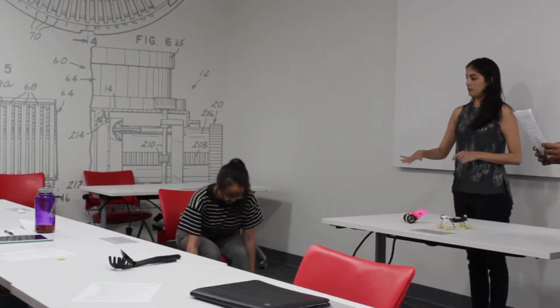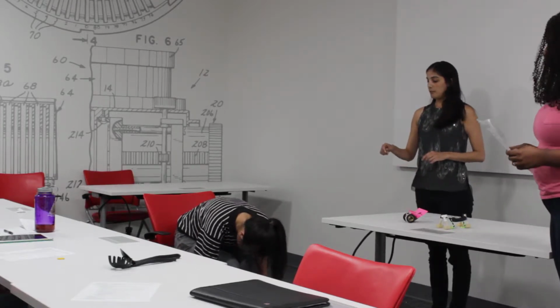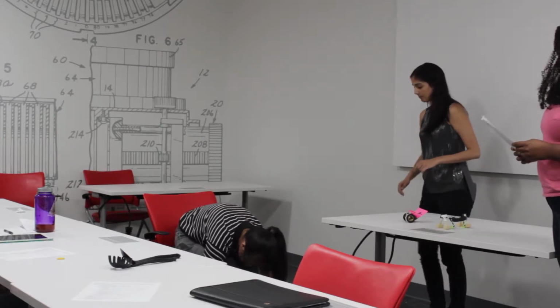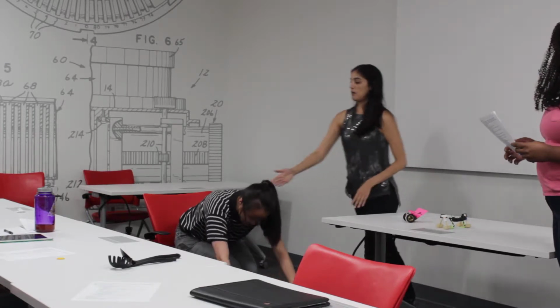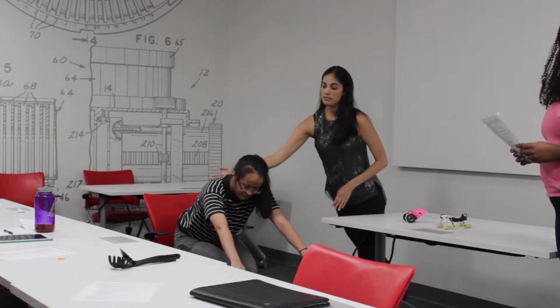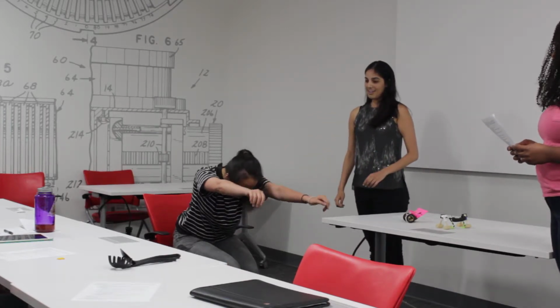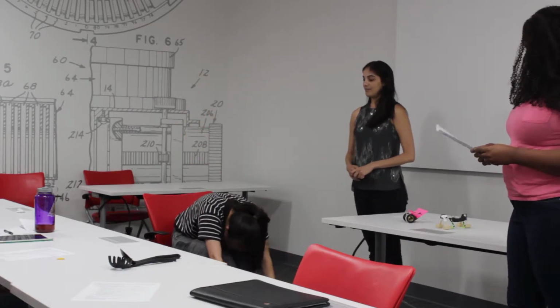So Amanda would roll up to the device, bend over, roll up. She then puts the t-shirt over the hooks and puts her arms in the sleeves. She then gets up with it pushing the bar. The bar would be around here. And whenever she wants, she can put her head through the gap. And then when she sits up all the way, her arms are above her head, and she can wiggle the t-shirt over her shoulder. When she's done, she bends over again and rolls back with the t-shirt on.